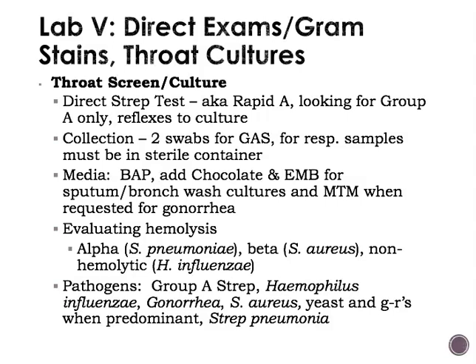So your kit test, which is usually done in 5 or 10 minutes, if that is negative, there is a possibility for false negative results in those kit tests because it might be too early to detect, or we might not have gotten enough organism for that test. So a negative result from the kit test always reflexes to a culture.